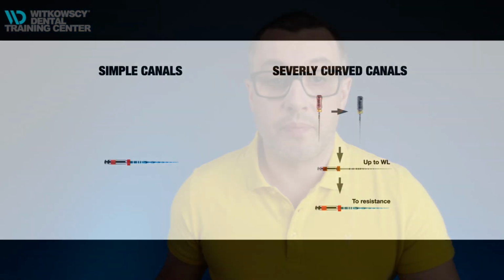And that was the most important part in this situation. So of course, when we obturate this kind of canal, when we make this mistake, we can save ourselves with proper irrigation followed by proper obturation. But in order not to make these mistakes, let me tell you how to do it.